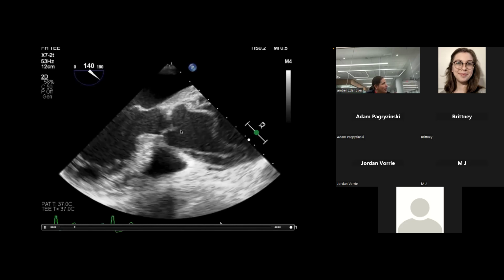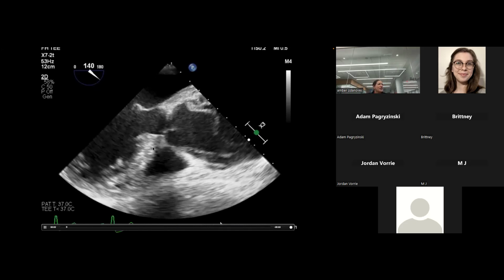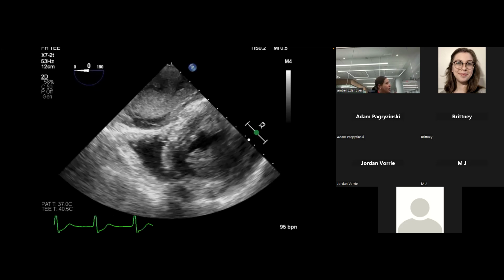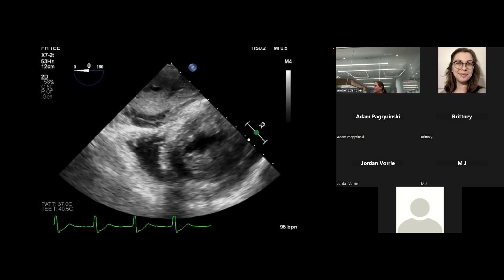So it's one of the 3 things that'll kill you with the type A. What do you think about this aortic valve? It's bowing sort of back. Do you think it's coapting well? No. So acute AI is going to be one of the things that will kill you with the type A. This is another thing that will kill you with the type A. So what is going on in this picture?